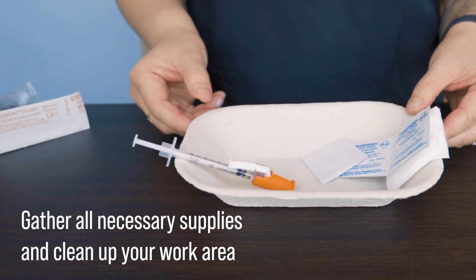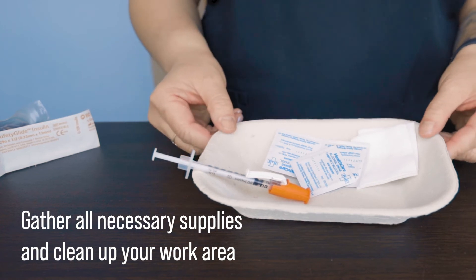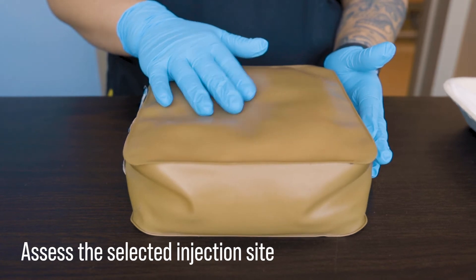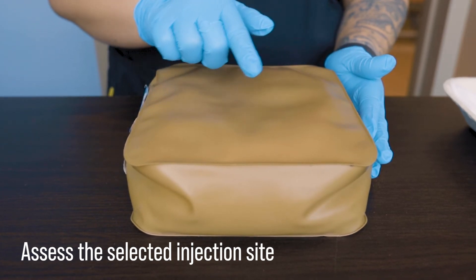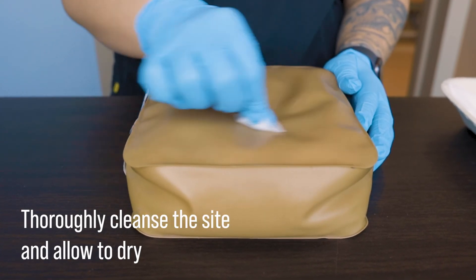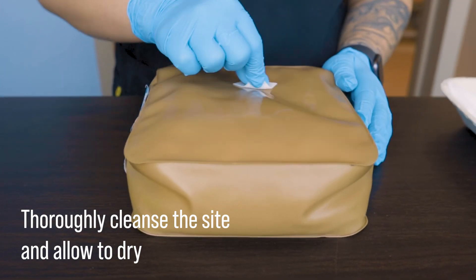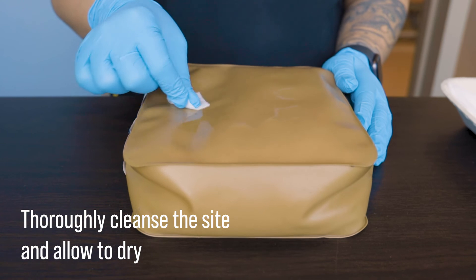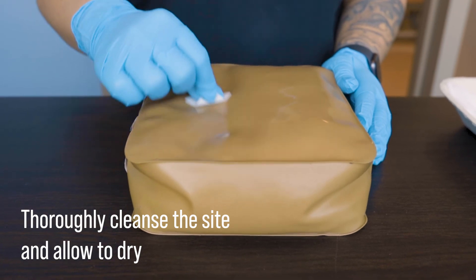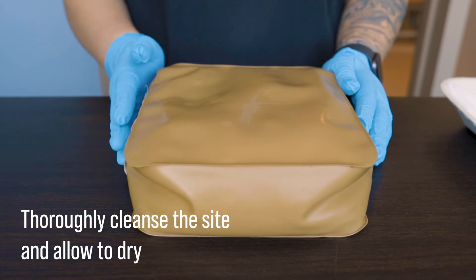Now that we're finished drawing up our medication, we can clear up our workstation and gather any other supplies we may need. Once we've identified our patient, we will assess the selected injection site, ensuring that we're following the correct site rotation. We then thoroughly cleanse the site with an alcohol swab. We can clean in an overlapping circular motion starting from the center, or we can use the hashtag technique. Just remember that some facility protocols require that an injection site be cleaned for at least 30 seconds and then allowed to dry thoroughly.